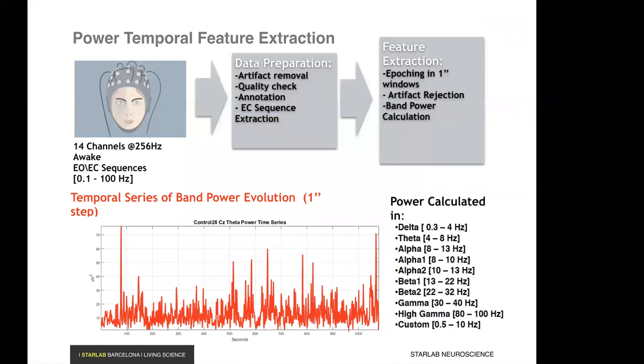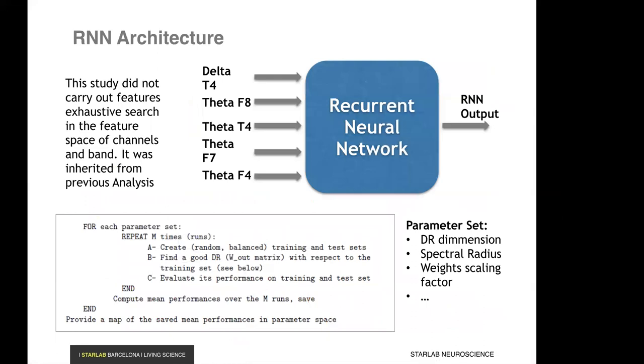More concretely, we have here 14 channels of EEG at 256 hertz from a few minutes of data. These are data preparation steps, artifact removal, quality check, annotations, the extraction of sequences, and then the computation of band power at one-second intervals. And in the bottom, you can see a graph of the time series of this power. And the idea is that hidden in this time series, which looks like a very noisy signal, there is information that can tell you if this comes from a patient who is a healthy control or is from an RBD patient that will convert into PD in a few years. And this can be done for different bands from the lower frequency to the higher frequency bands of EEG.